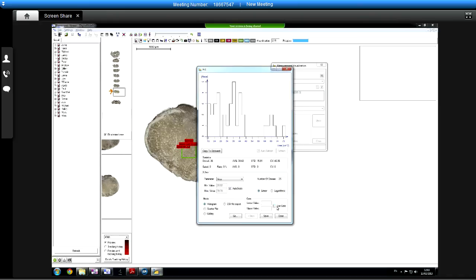And then I can regenerate the data file based upon that by selecting CSV file export and hitting go. I can also review that, so I can jump to the gallery now. If I hit gallery there and hit go, I can now just review those ones, for instance.